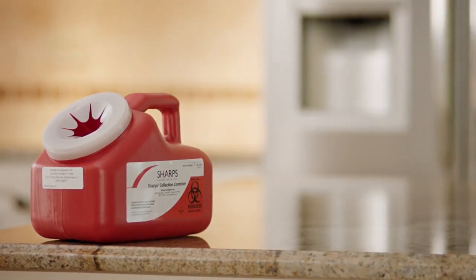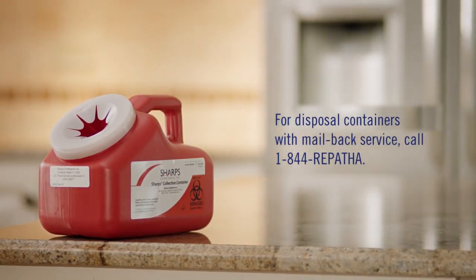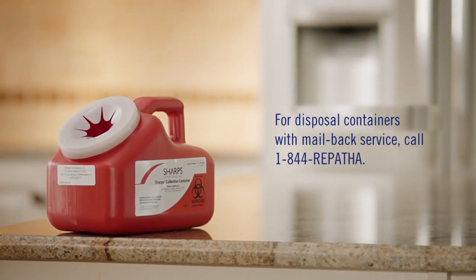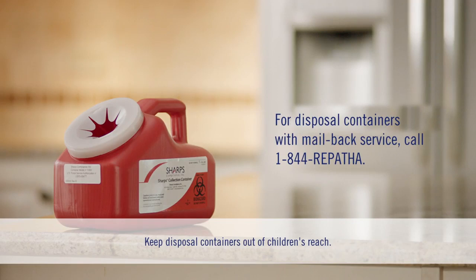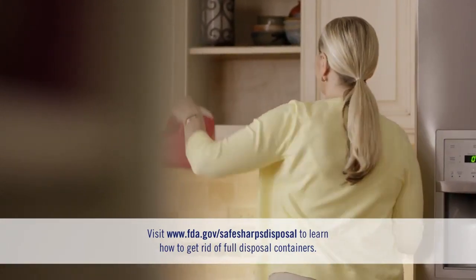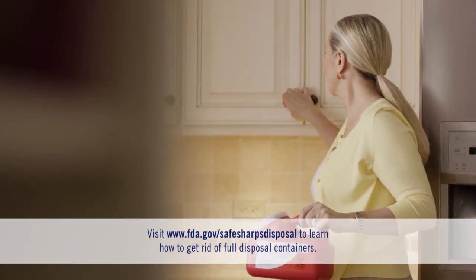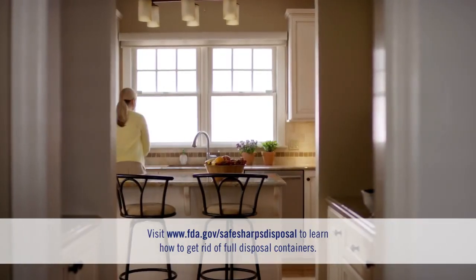If you need FDA-cleared disposal containers, you can get them from your local pharmacy. Puncture-resistant disposal containers with mail-back service are also available from Repatha Ready — just call 1-844-REPATHA. Be sure to keep disposal containers out of children's reach. Local and state laws may require you to follow certain rules. Do not dispose of your used sharps disposal container in your household trash unless your community guidelines permit this, and do not recycle it. For more information about proper needle disposal in your area, contact your local health department, trash removal service, or check out the FDA's website listed on screen.